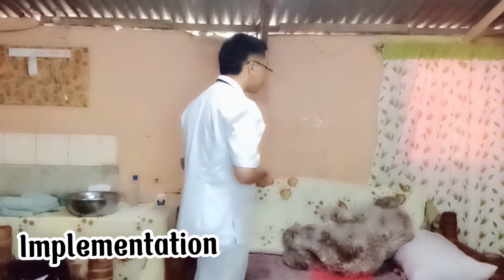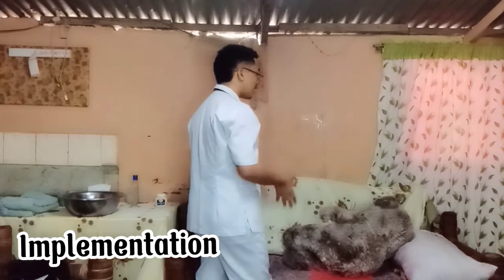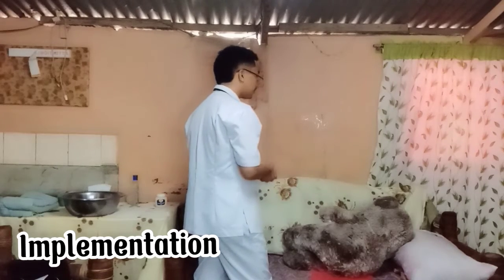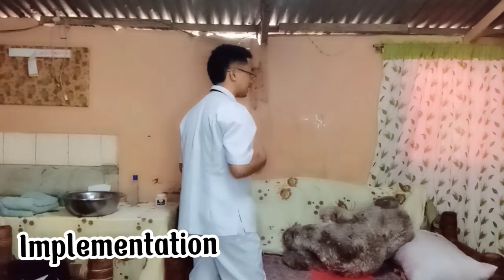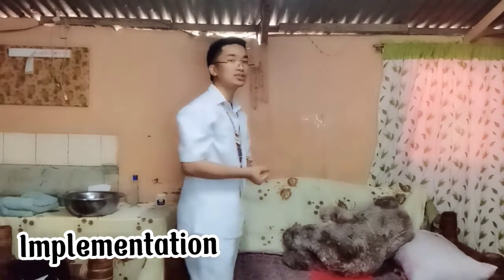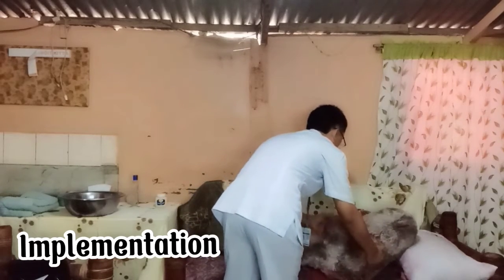So ma'am, are you willing to maintain lying down for 5 to 10 minutes for the cleansing enema and 30 minutes for the retention enema? Okay, so I'm going to help you, ma'am, lying down.